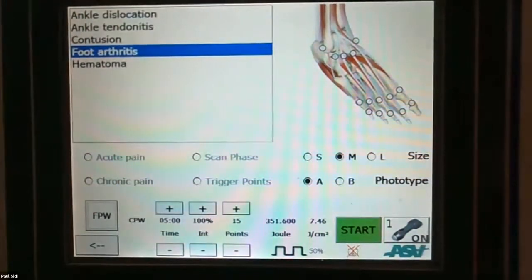Now, let me just come back and explain this if I can. I've done a lovely bit of drawing here, which hopefully will help you. I told you there's two wavelengths of light going into this through this laser head. There is a continuous wave, in inverted commas, and then there's the pulse 905. 808 continuous, 905, 25 watts, super pulse. Right, let's have a look at it.